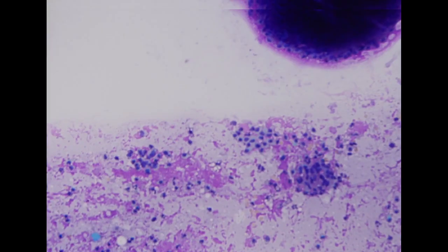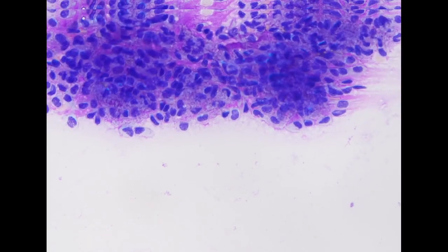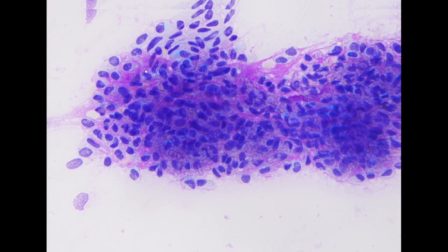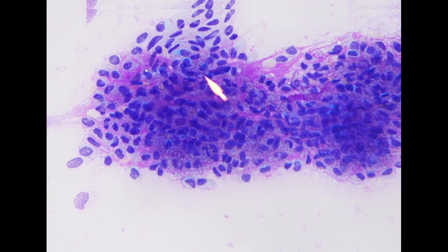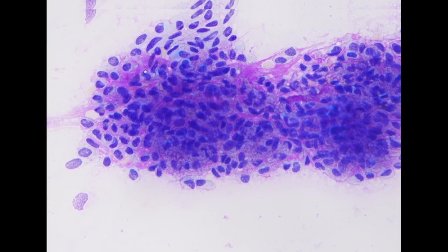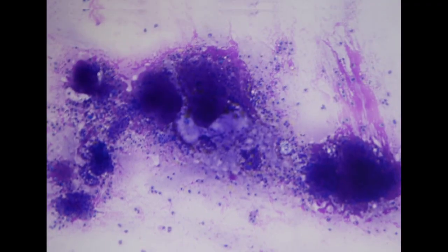If you see another type of tumor, for example adenoid cystic carcinoma, usually the matrix material is very dense, and it will push the cells to the edges. So it is different. Here you see fibrillary matrix, all the myoepithelial cells are embedded in the matrix, and we do not see any atypical cells. So this is diagnostic for benign pleomorphic adenoma.